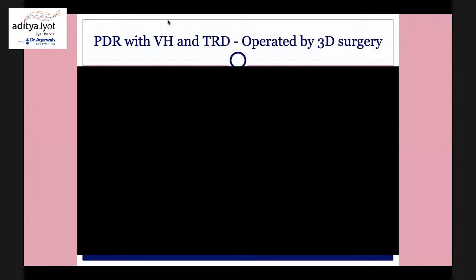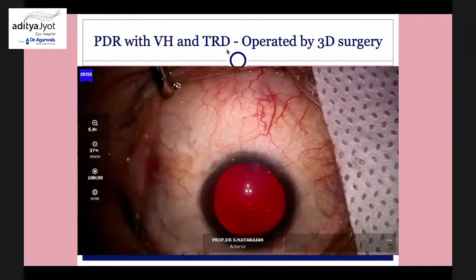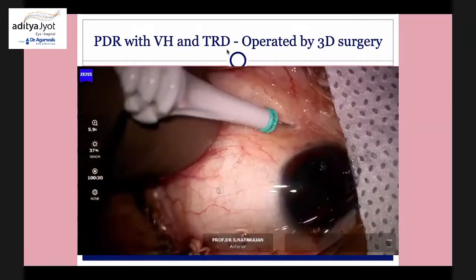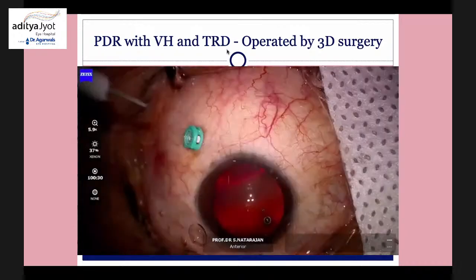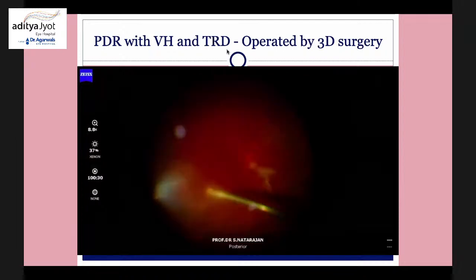And this is a PDR which I recorded through the system. I'm using it, and I do a beveled entry so that you can see the clarity is definitely much better. And then you clear the anterior posterior traction, and then remove the vitreous hemorrhage.